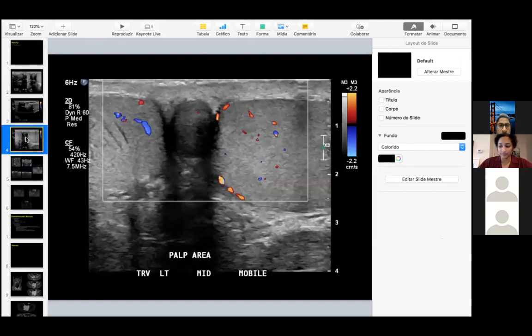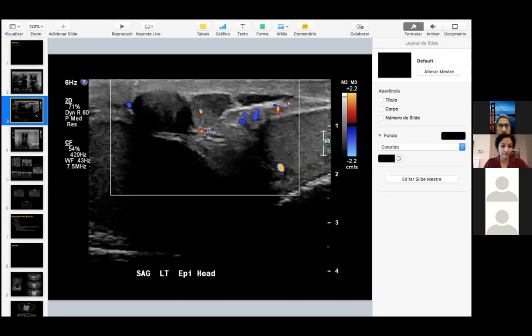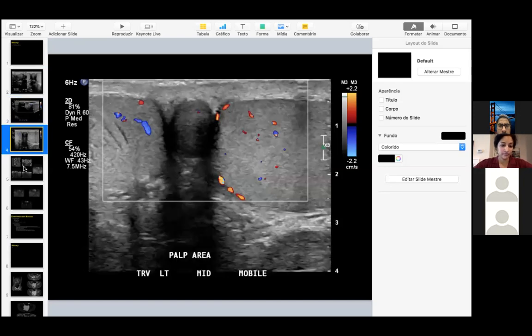Show you a couple more pictures here with Doppler. Again, here it is separate from the testicle. And one more observation is that on the ultrasound it's relatively hypoechoic, and it has what we see as posterior acoustic shadowing. This is something we can see in things like fibrothecomas, for example, in the female pelvis. So I thought that was an interesting comparison. I'm going to show you the MR now.